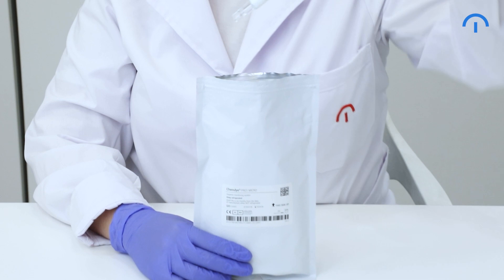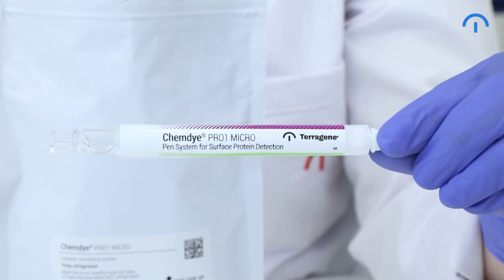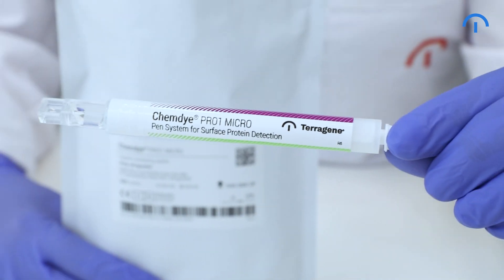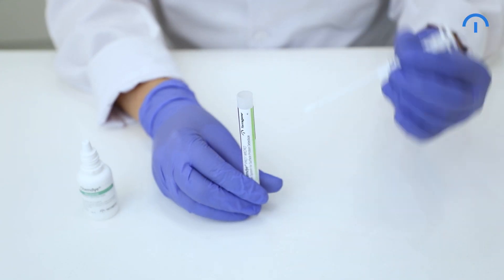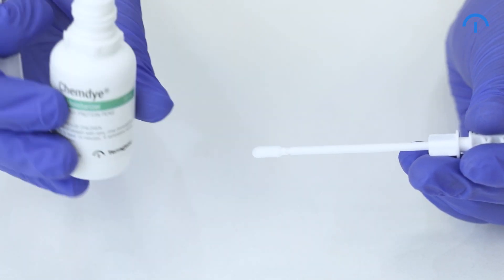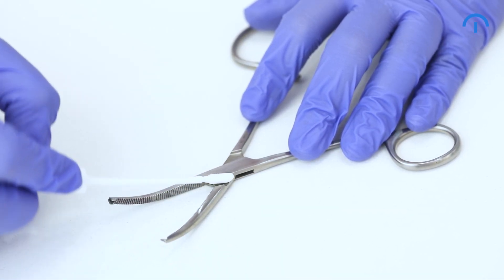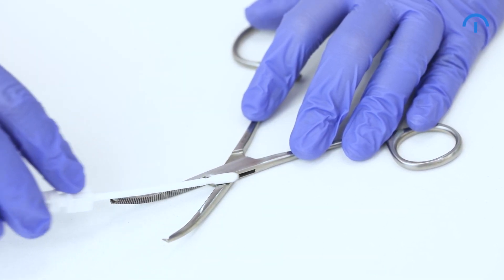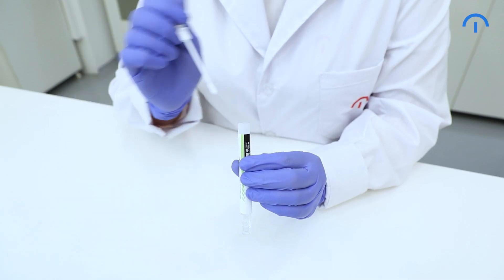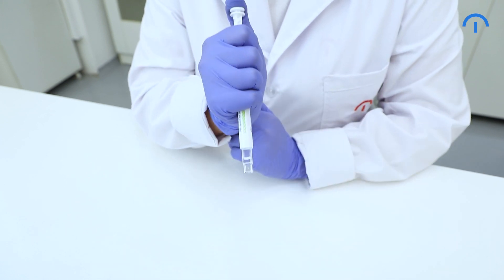Before swabbing, it's important to remove the Pro-1 from the pouch and allow it to reach a temperature of 20 to 25 degrees Celsius. Remove the swab from the device and carefully apply two drops of moisturizer on the swab tip. Swab thoroughly the instrument's surface, pressing the swab and rotating it several times while collecting the sample. Place the swab back in the device and activate it by pressing it firmly downwards.